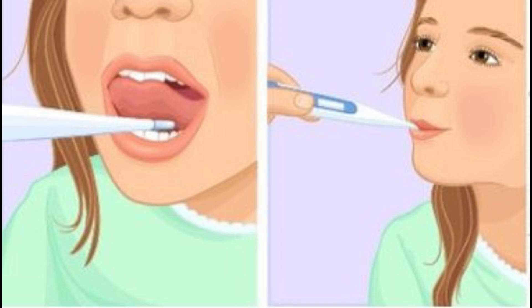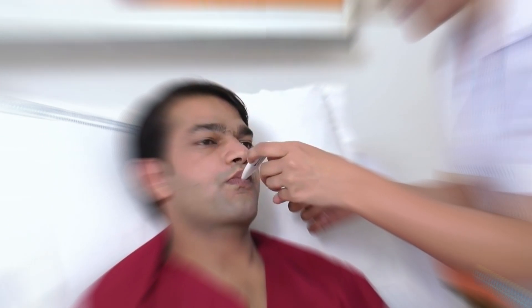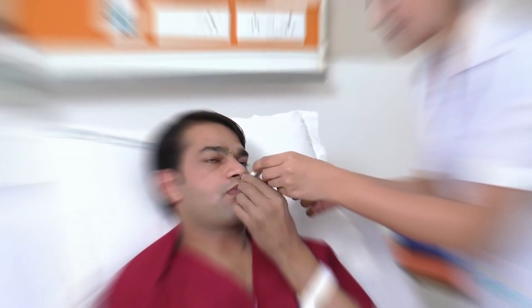First is the oral area. If you would like to check the oral temperature, keep the thermometer just below the tongue and hold it under the tongue for one full minute.